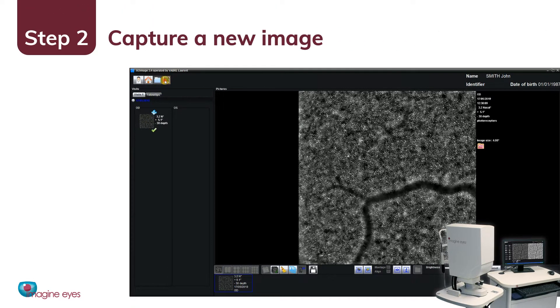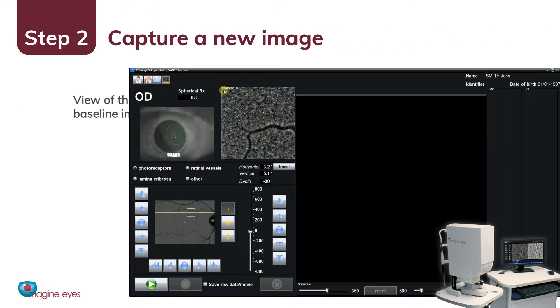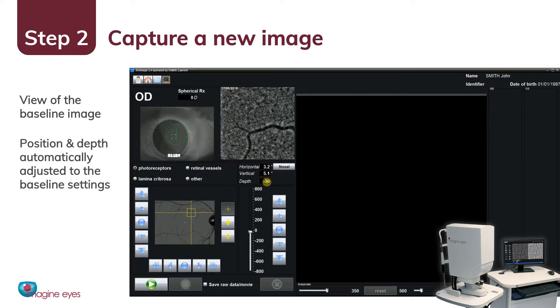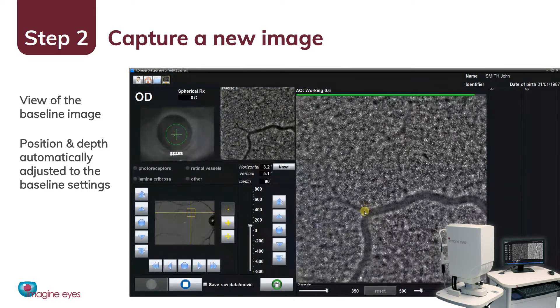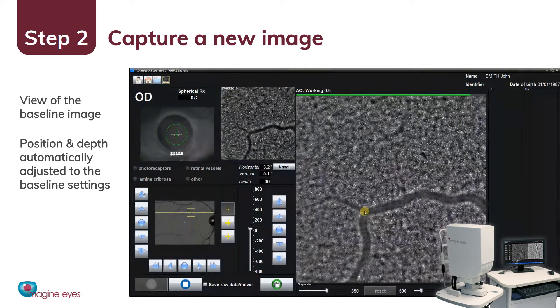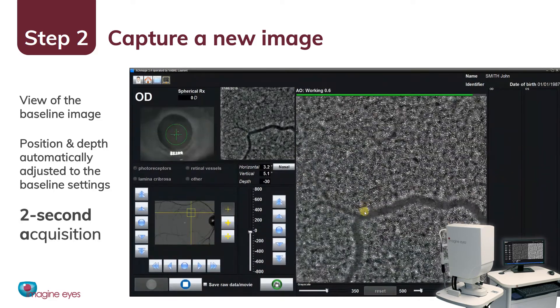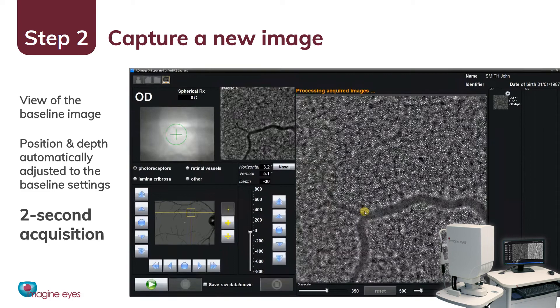Then, capture a new image. A view of the baseline image is displayed. Image position and depth were automatically adjusted to the baseline settings. Simply align with the pupil and adjust the focus of the live retinal image. After a two-second acquisition, the follow-up is done.